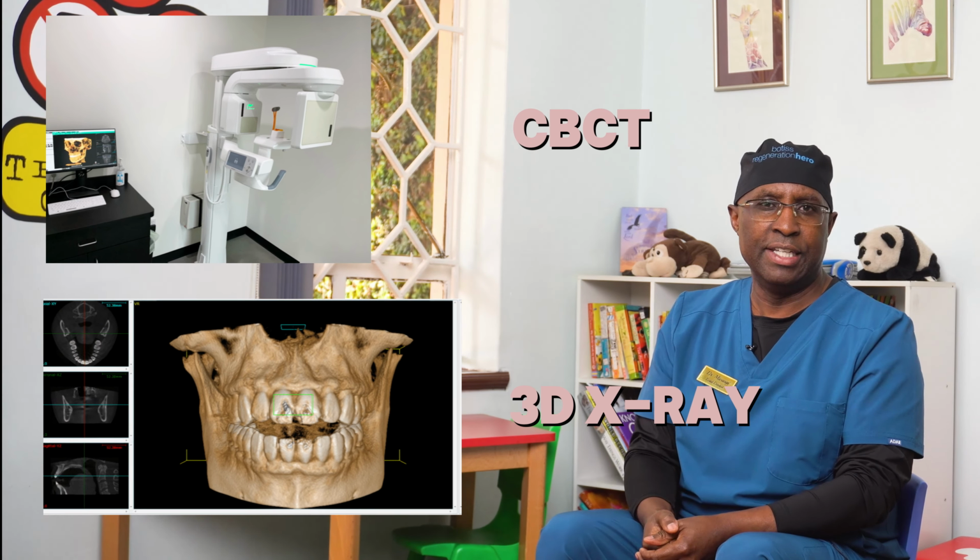There is one third x-ray I would mention called a CBCT, a 3D x-ray. That is very, very new in the market. That is a recent addition in the market. That particular machine, we don't have it in our office, but we hope to get it in the near future.